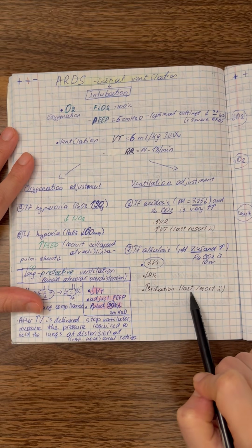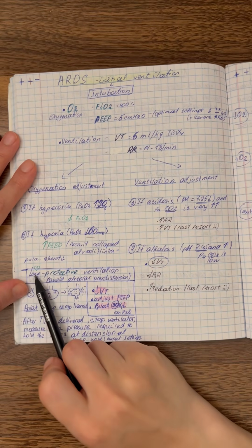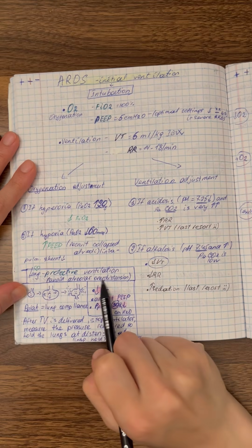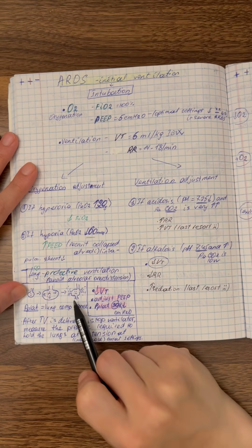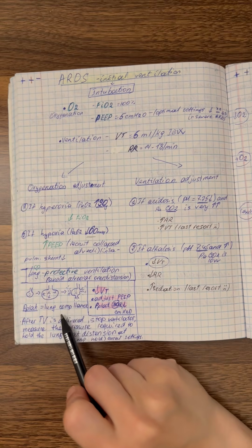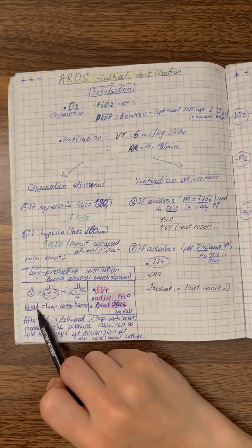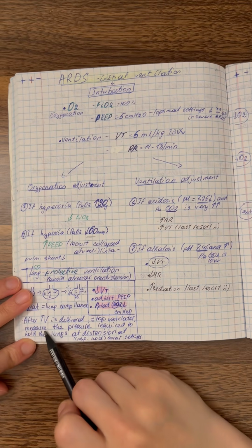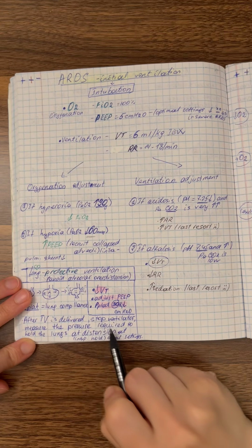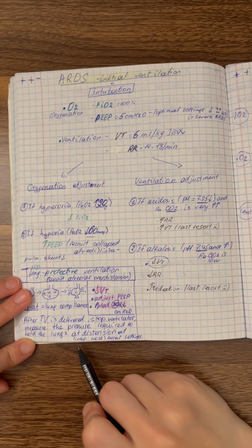And lastly, let's talk about a very important point. When managing mechanical ventilation, one of the key principles is lung protective ventilation, which helps prevent alveolar overdistension and lung injury. How do we achieve this? A crucial step is evaluating lung compliance by measuring plateau pressure, P-plat. This is done using an inspiratory hold maneuver, where the ventilator is paused briefly after delivering a tidal volume. The pressure recorded at this moment reflects lung compliance and alveolar distension.